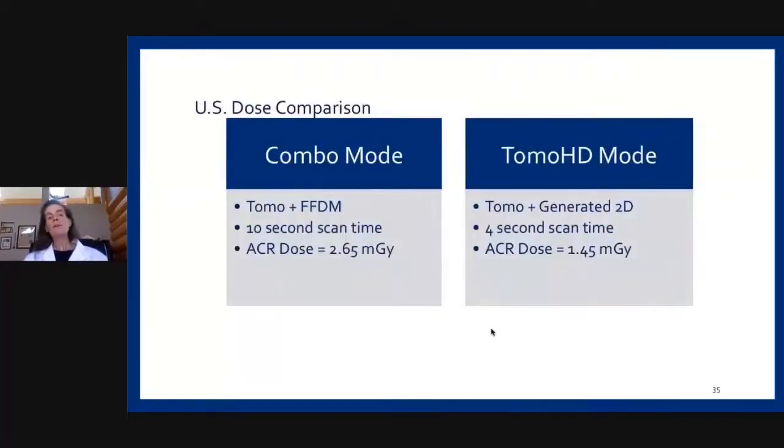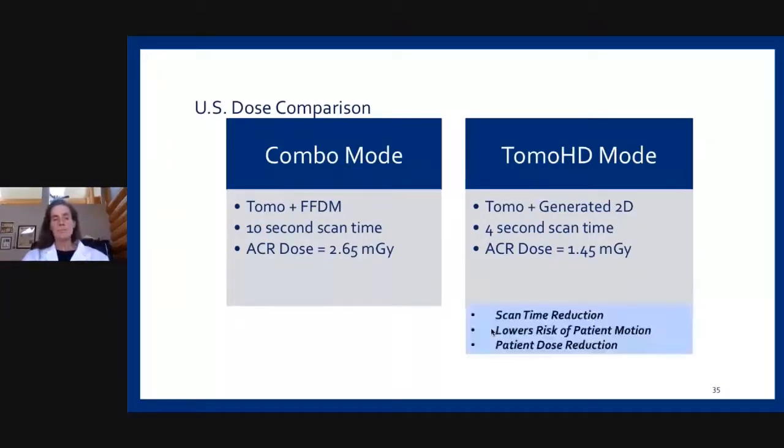So when we compare dose, because of course, when we started doing tomosynthesis, patients were concerned about how much dose they were getting. Is it going to be too much? And what is nice with the synthetic view is that we're able to decrease dose significantly. Both doses are well within limits of what we're allowed to perform on patients, but the synthetic view does really decrease our scan time and decrease our dose.